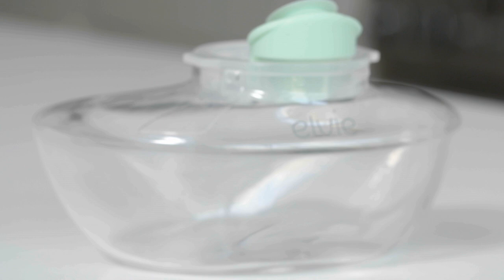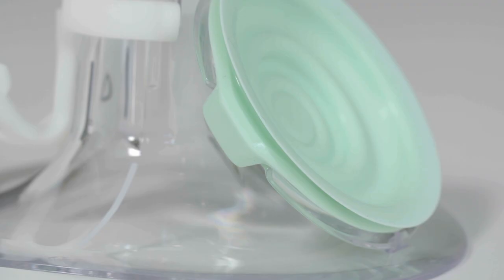Before you put the Elvie Pump together, make sure all the parts are dry, especially the seal.